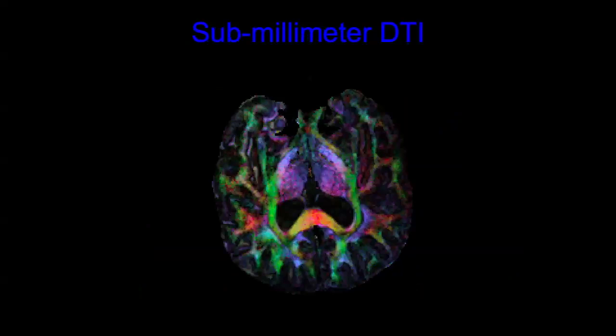So one solution would be to increase the image resolution. If you can get low enough, then you can get a nicely sampled voxel that's got less partial volume in it. This is an image from some of the work that we did a few years back where we did sub-millimeter DTI. We did not use single-shot EPI. We used a different acquisition method, radial fast-spin echo, to be able to acquire this.